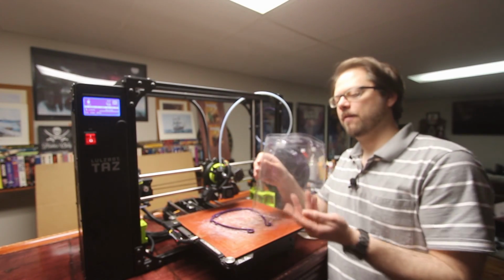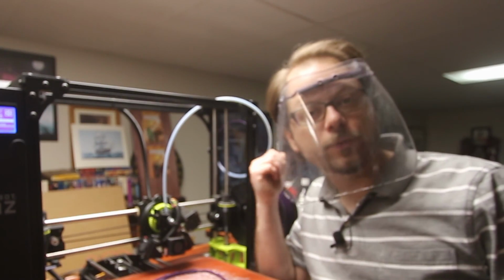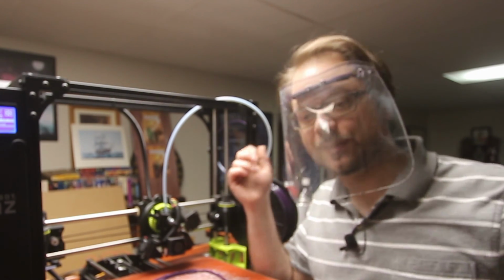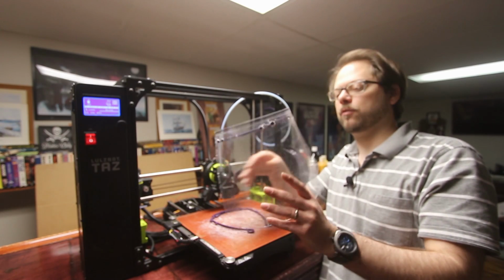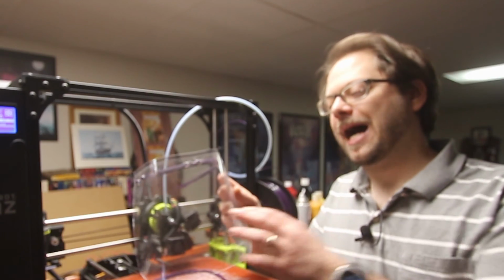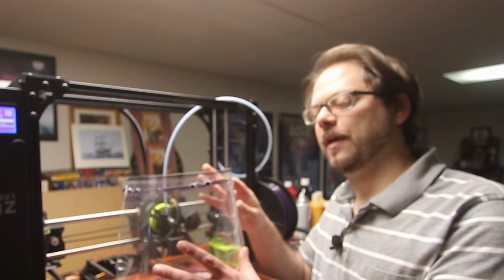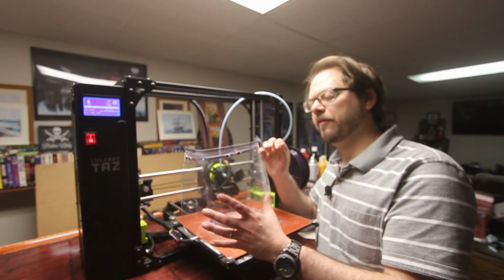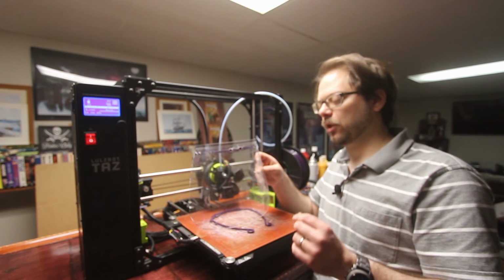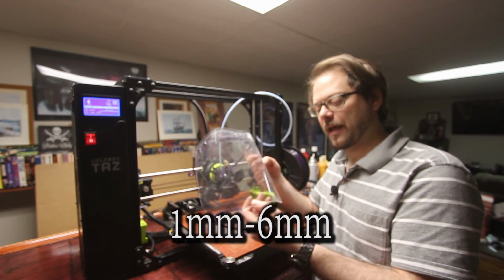Okay, so here we have our first functional full face mask that could be used to help prevent the spread of infectious disease. Now, there's already several different things that I would change about the design to make it better. Obviously, this is not the best plastic for this face mask. It would be better if we could find a plastic that was a little bit thinner, just a little bit more flexible. That would also make it a little less brittle around the edges.